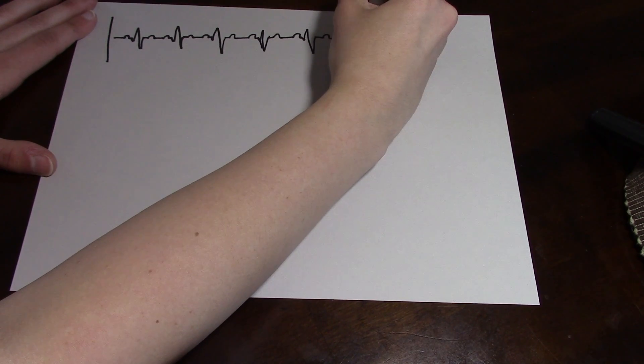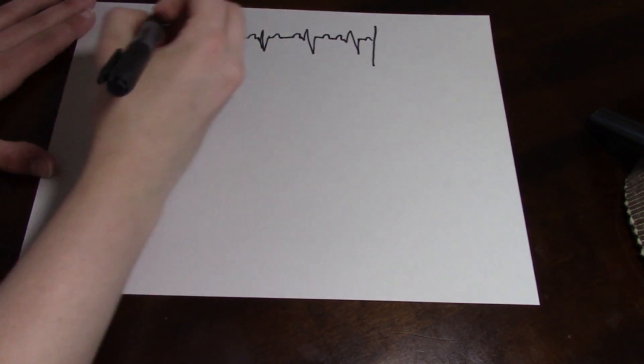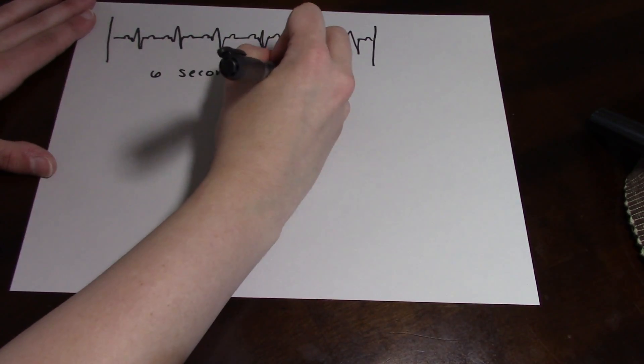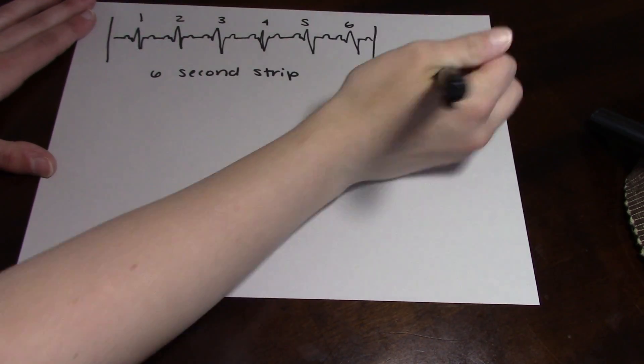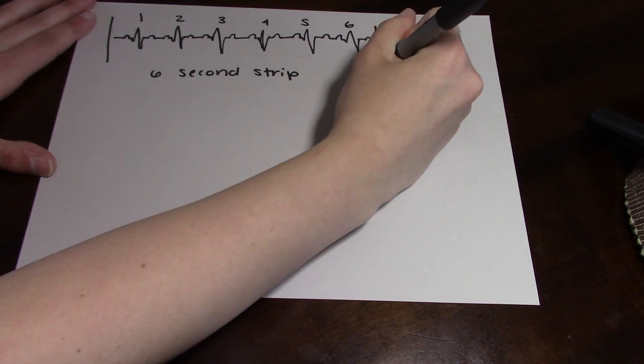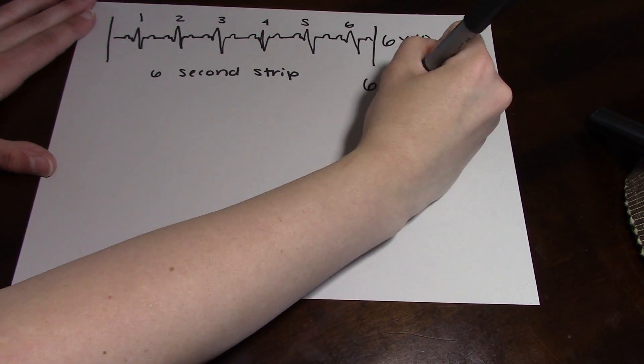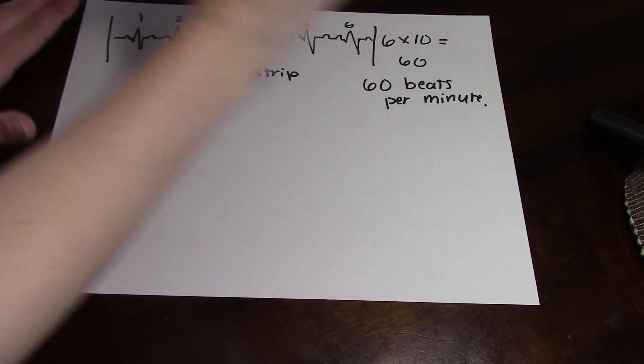The first way is just by counting the number of R's there are, or the QRS segments, and then multiplying that by 10. Because it's a six second strip times 10, it gives you 60 seconds. So if you have six QRS's, then this rhythm is going to be 60 beats per minute.